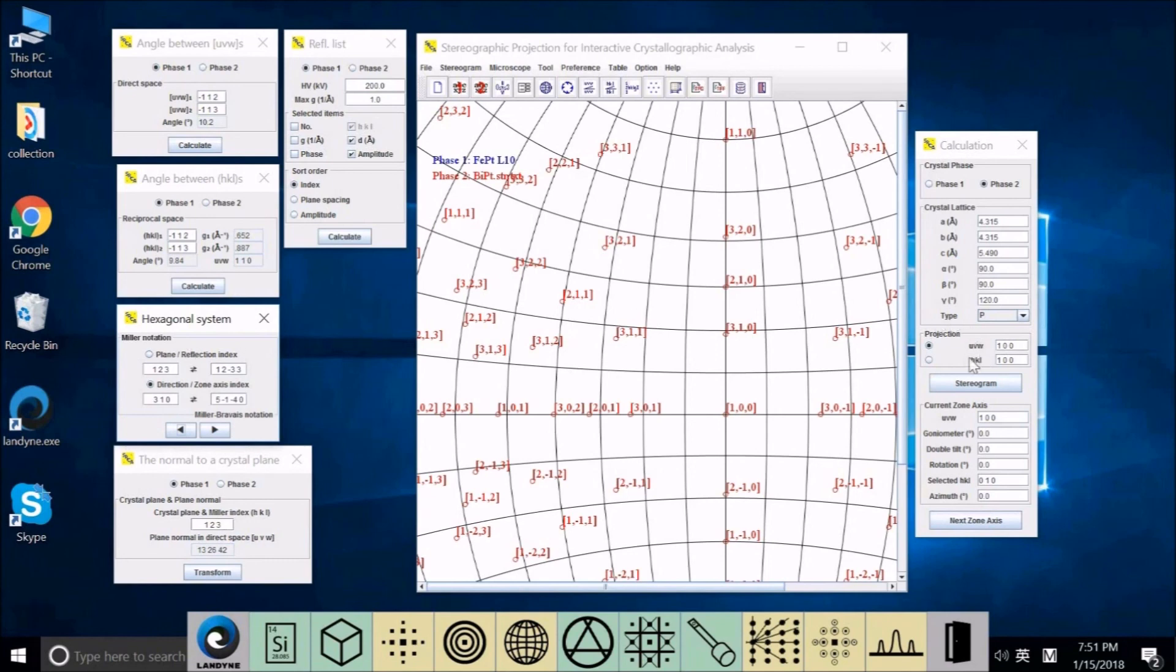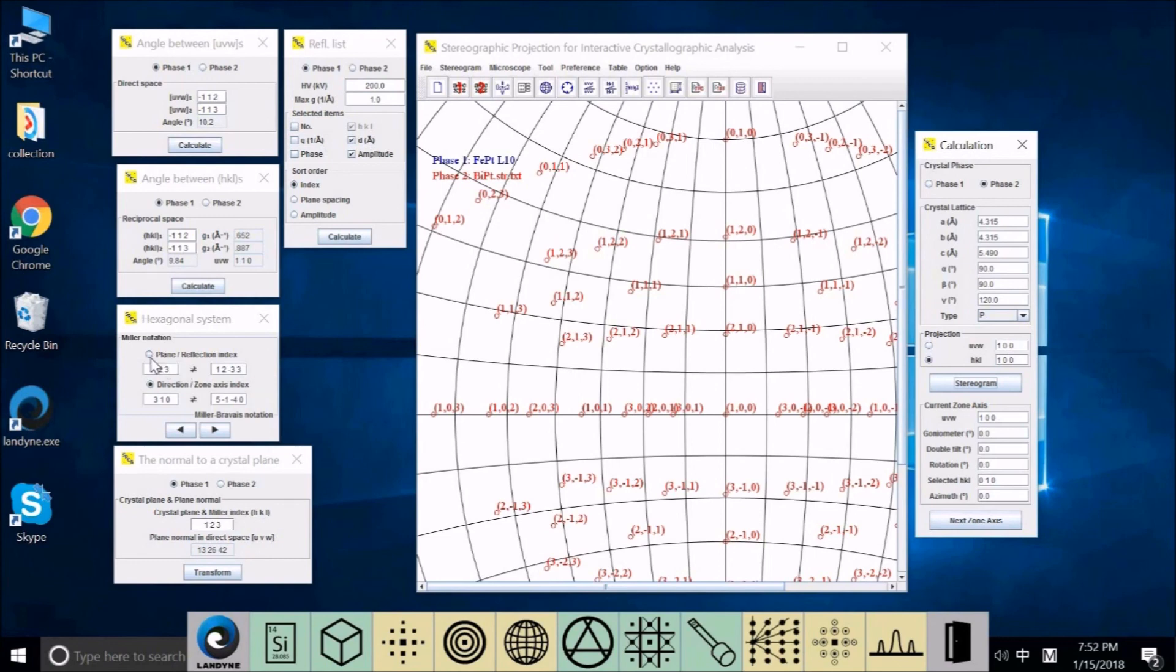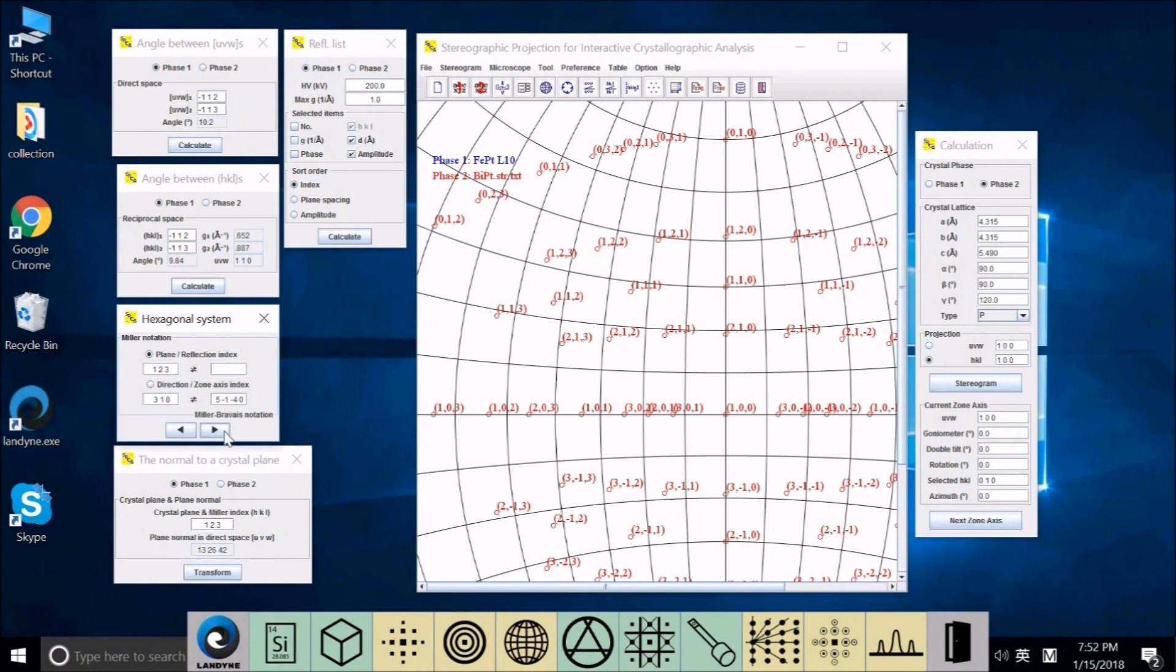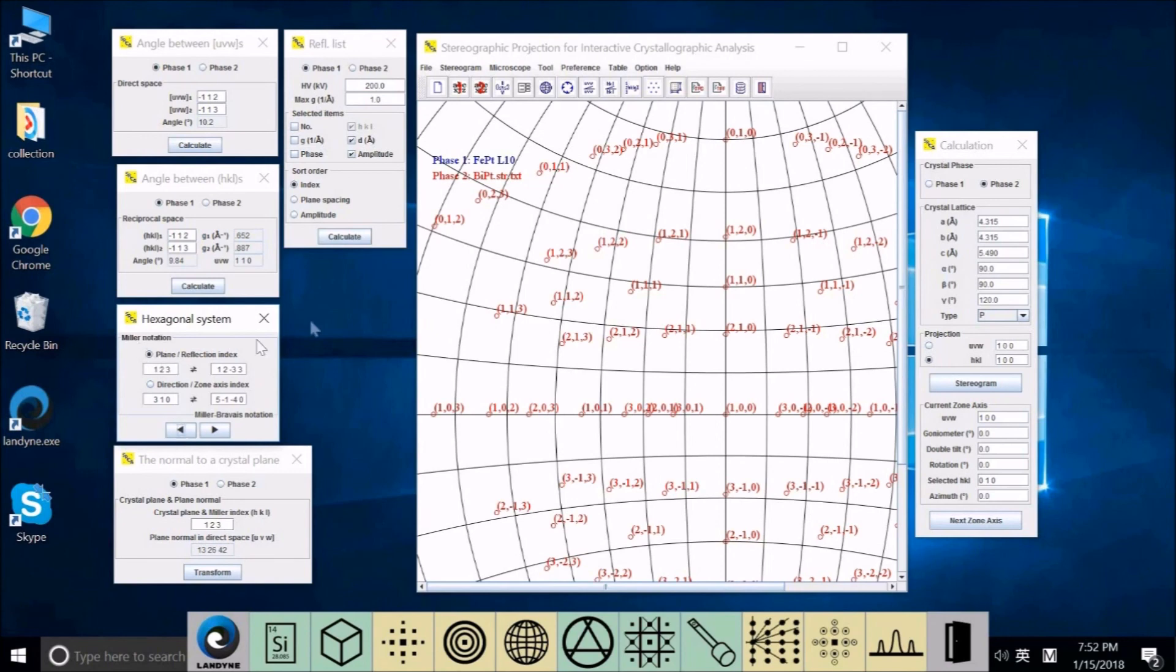And the same way, try to find out the zone axis in Miller-Bravais 5, minus 1, minus 4, 0. And you put this here and put here and got exactly back 3, 1, 0 zone axis. For the reflections it's the same. Let's try reflection like 1, 2, 3. You want to know what it is in Miller-Bravais system. Exactly we already have 1, 2, 3 here. And you click Forward. So you get 1, 2, minus 3, 3. This is easier, just H plus K, put minus in front of it. Same thing if you don't know the Miller-Bravais indices, you put here, you got 1, 2, 3 back.